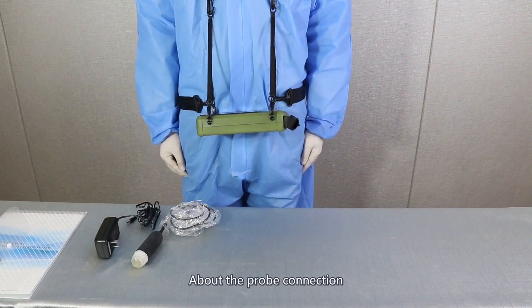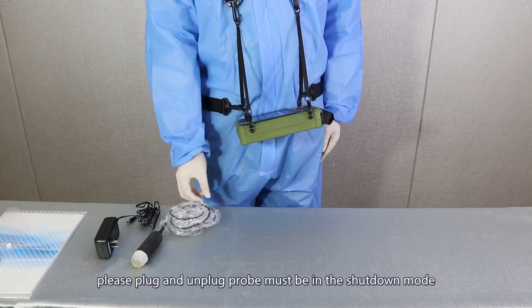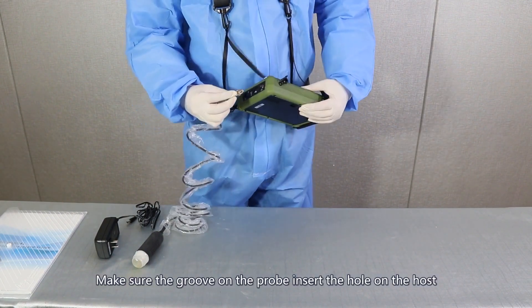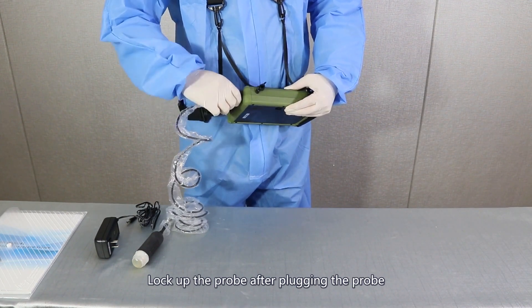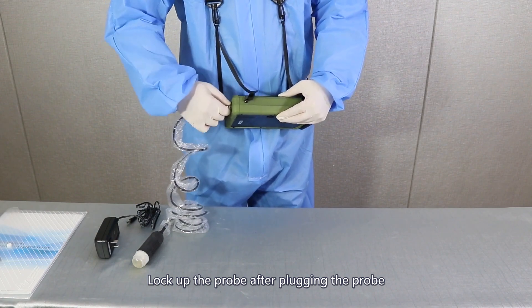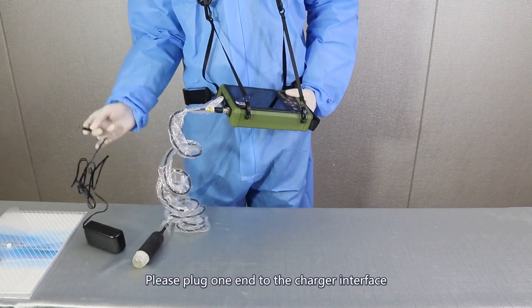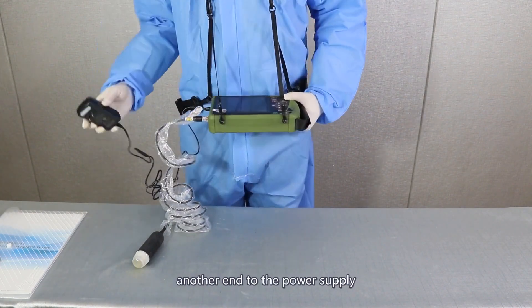Instrument installation. About the probe connection, please plug and unplug the probe only in shutdown mode. Make sure the groove on the probe inserts the hole on the host. Lock up the probe after plugging it in. About the adapter connection, please plug one end to the charger interface, another end to the power supply.